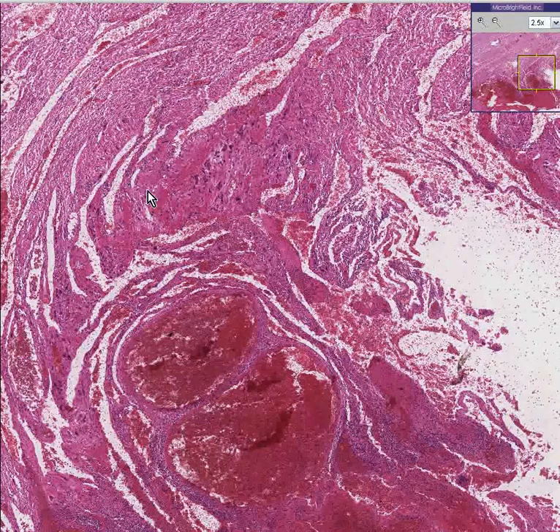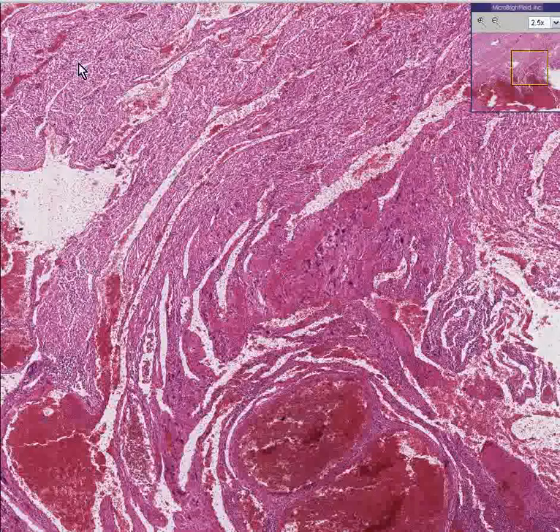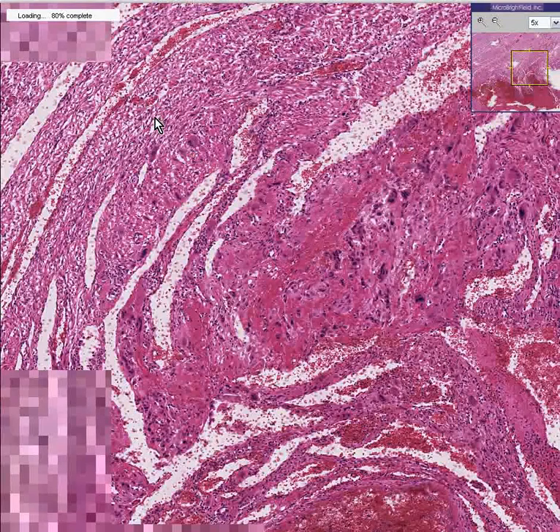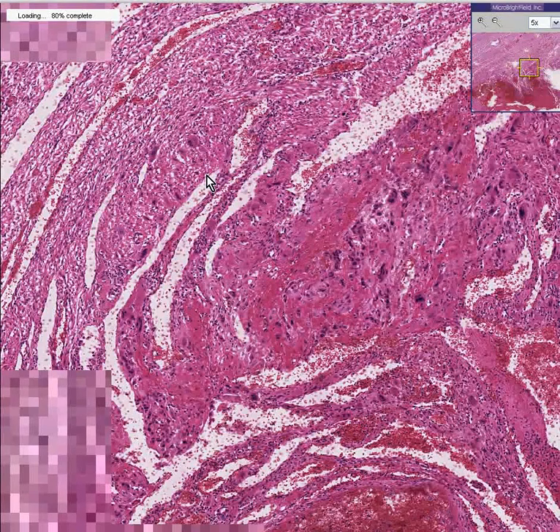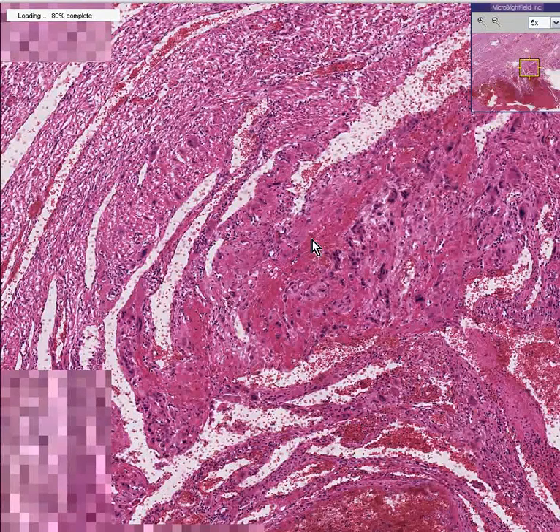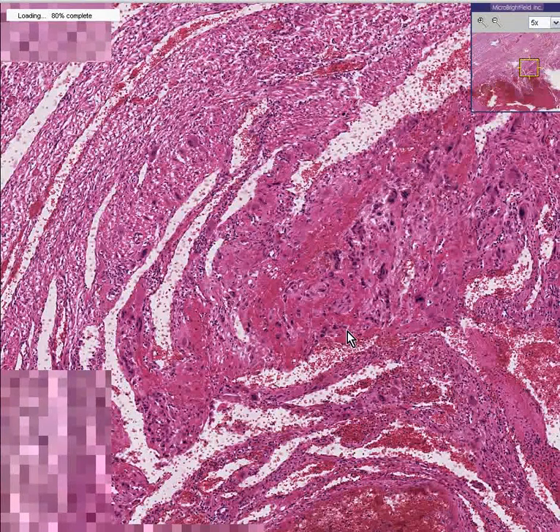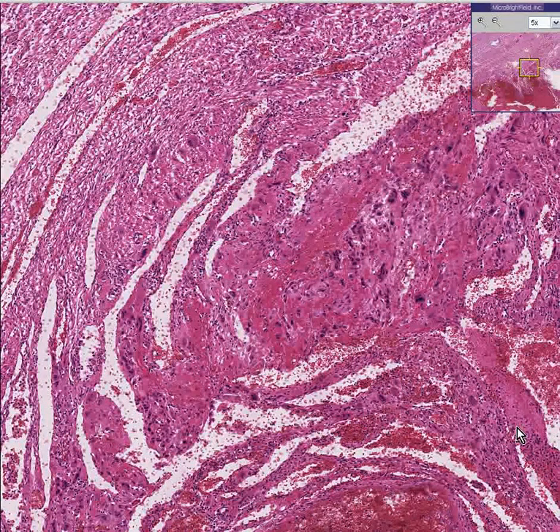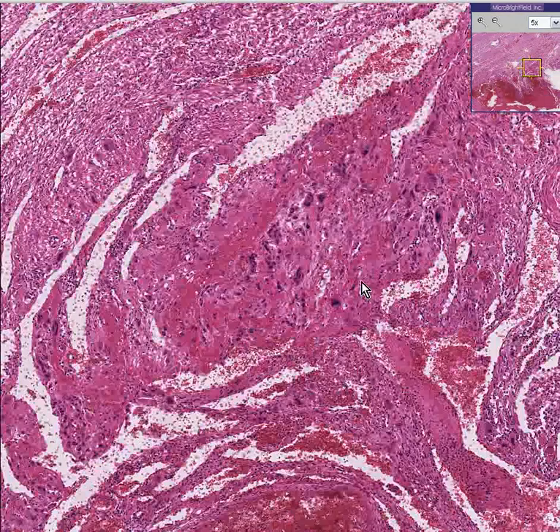Here is a myometrium. Here's the muscle, and you can see it looks like normal smooth muscle. And as you get more towards the endometrium over here, you can see there's a lot of hemorrhage, a lot of fibrin, a lot of inflammatory cells. And lo and behold, what are these big, ugly, nasty cells?